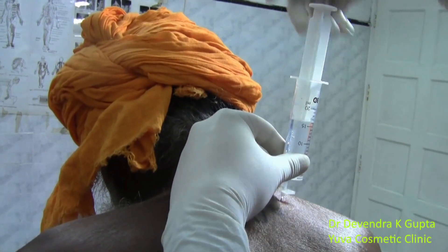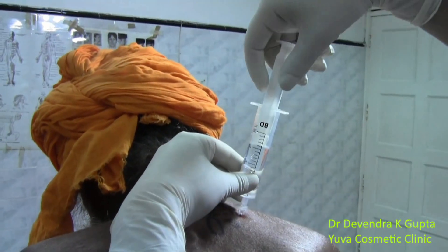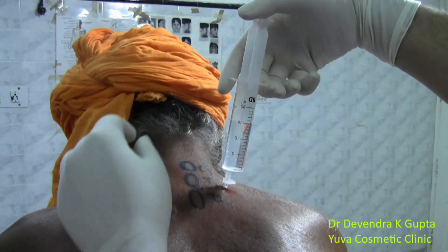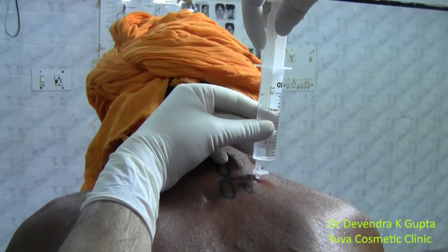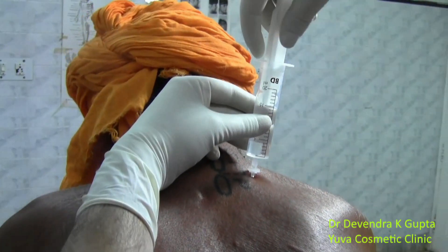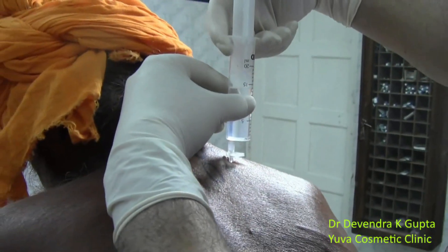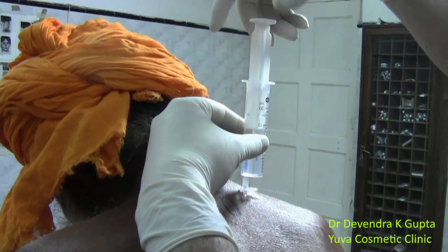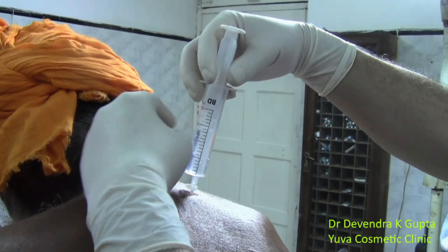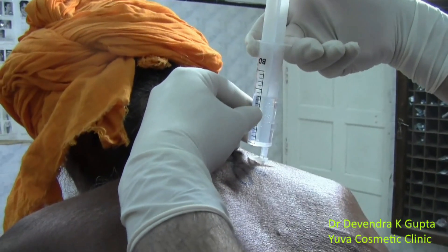Now there is no resistance here. Always inject after aspiration. If there is coughing, it means you have touched the pleural membrane. Now the needle is fine — it takes time. Always aspirate and keep watch on the monitor to look for any bradycardia or a sudden change in the pulse.